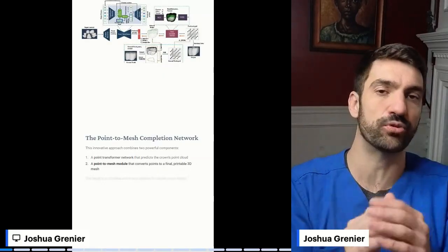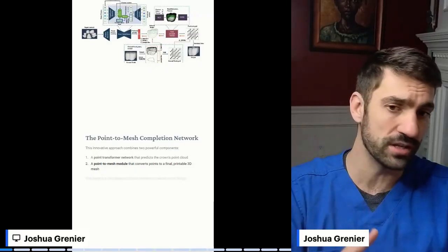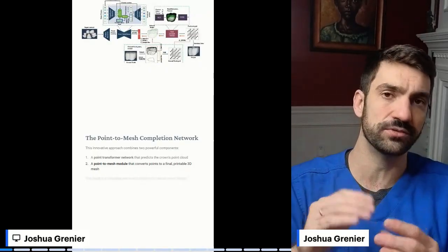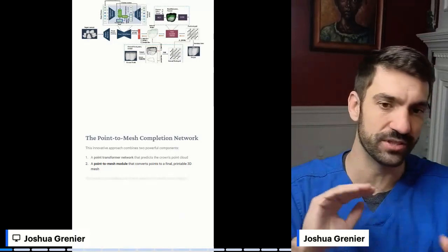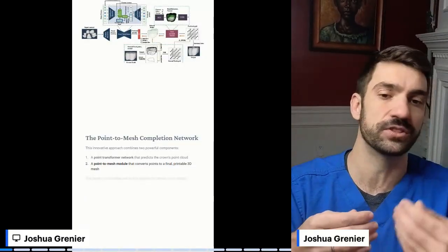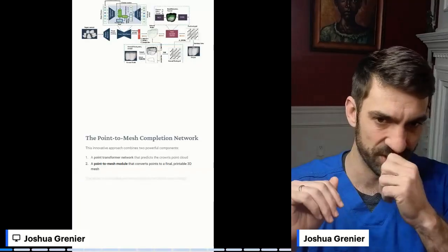It sees broader features because you couldn't run 10,000 or 20,000 points through a transformer model. It's just simply too many. So it has an ability to see broader features, which for us would be cusps or neighboring teeth, marginals, or stuff like that. It probably sees it differently, but that is essentially what it's doing. So it's breaking this down into larger feature regions.